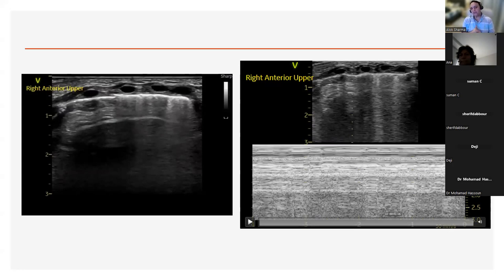So if you didn't have lung ultrasound, it's just being used as a diagnostic adjunct over here. But for the latter scenario, I don't think anybody would wait for a chest x-ray. You'd needle. I've been in a situation where we've had bilateral pneumothoraces. They're very difficult to diagnose if you have bilateral tension pneumothoraces, where we've empirically needled in that situation. We've got air from both sides.